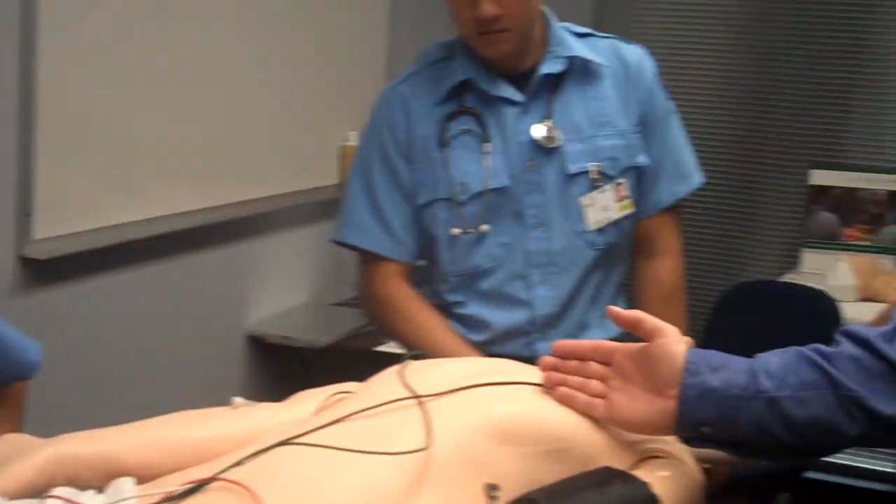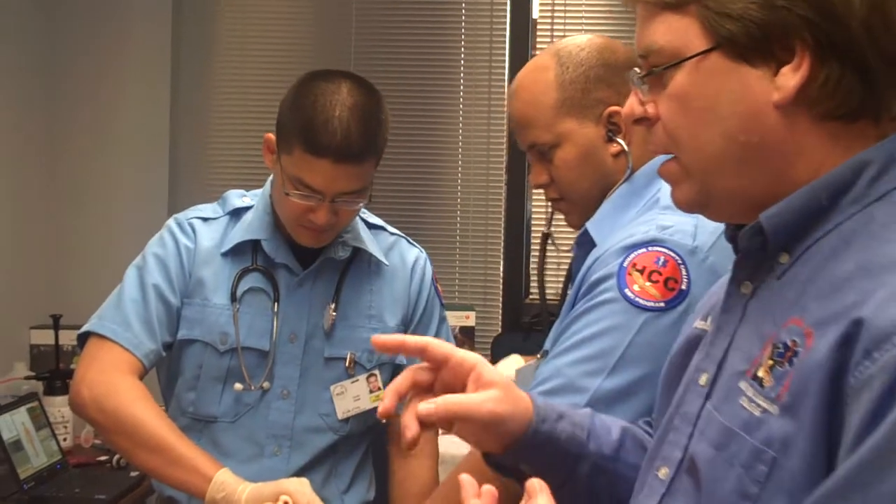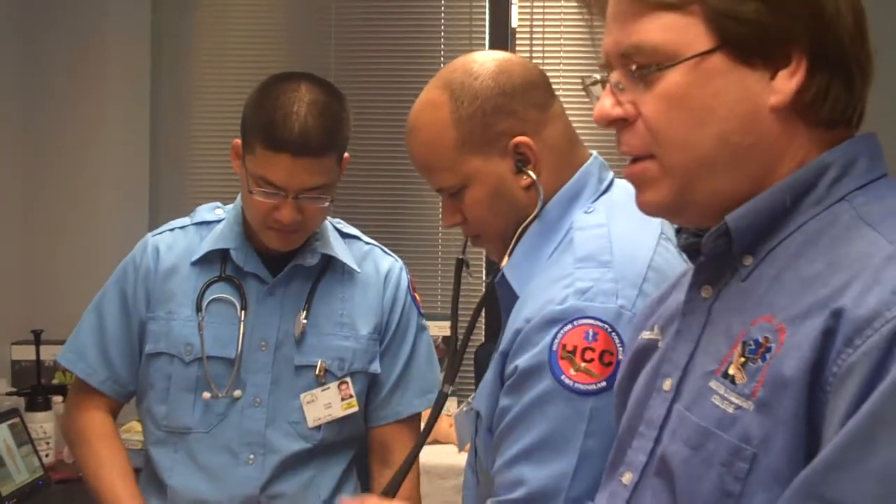You can listen to breath sounds and hear different breath sounds — you can hear wheezing and rhonchi. We can put IV fluids in. We can defibrillate the mannequin if we needed to.